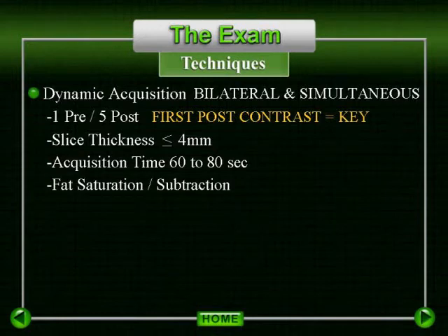This dynamic acquisition optimally should be obtained with fat saturation techniques. However, in the absence of this capability, subtraction imaging is sufficient provided your technologists are able to adequately position the patients to reduce any motion artifact. We find it useful to utilize both fat saturation and subtraction techniques.